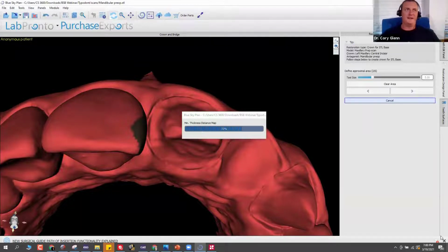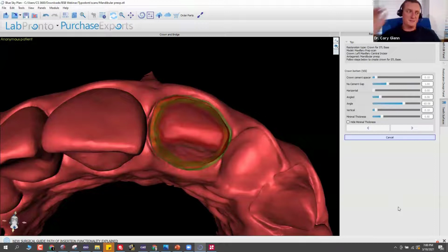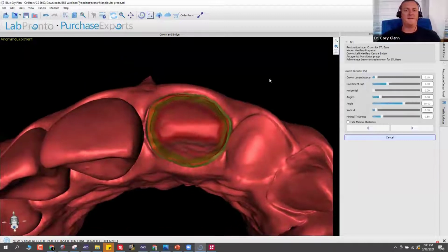Now, with that said, and I've got some that I'll show you, I have used this material to print at this point probably 15 to 20 full arch hybrid restorations. And those got to take a beating. I mean, they have cantilevers and all that stuff, and they can really have trouble holding up, even to stuff like PMMA. I've got 15 to 20 arches of those out in the wild that I've designed for people, and they've delivered.